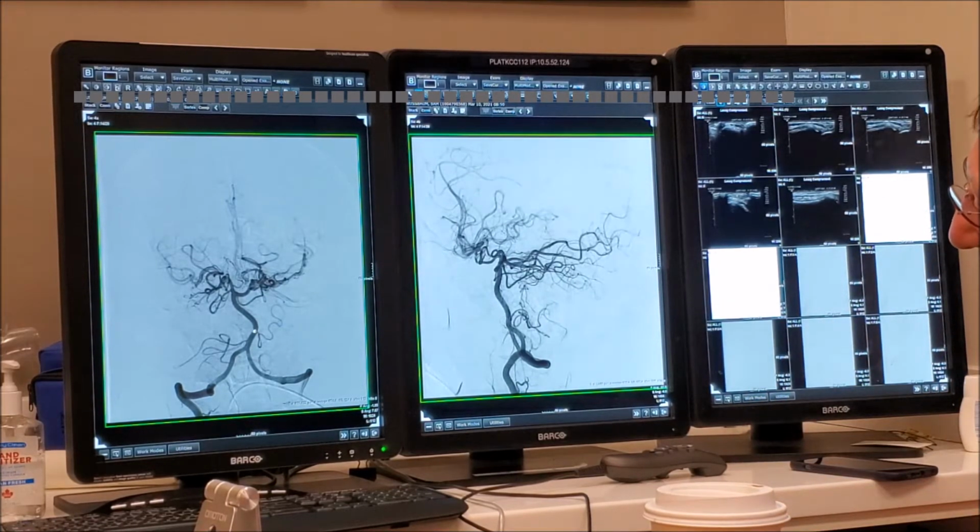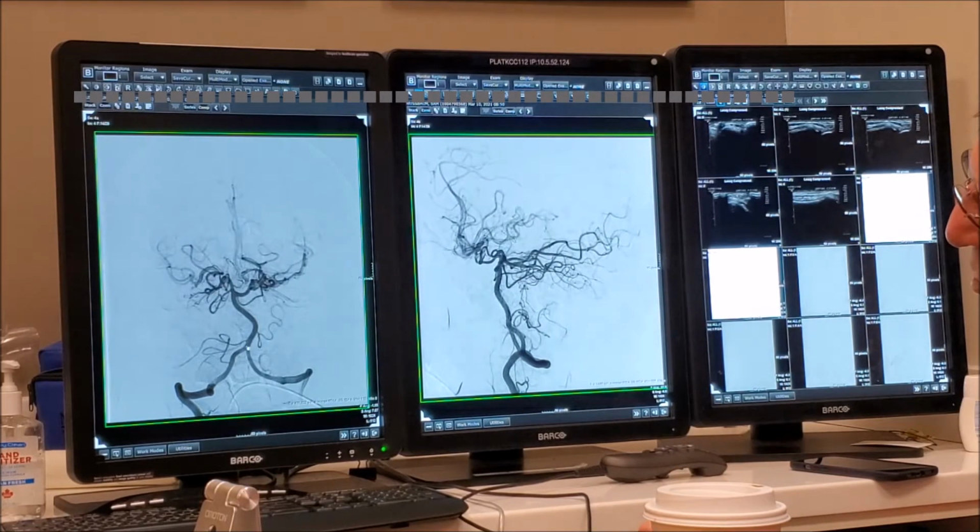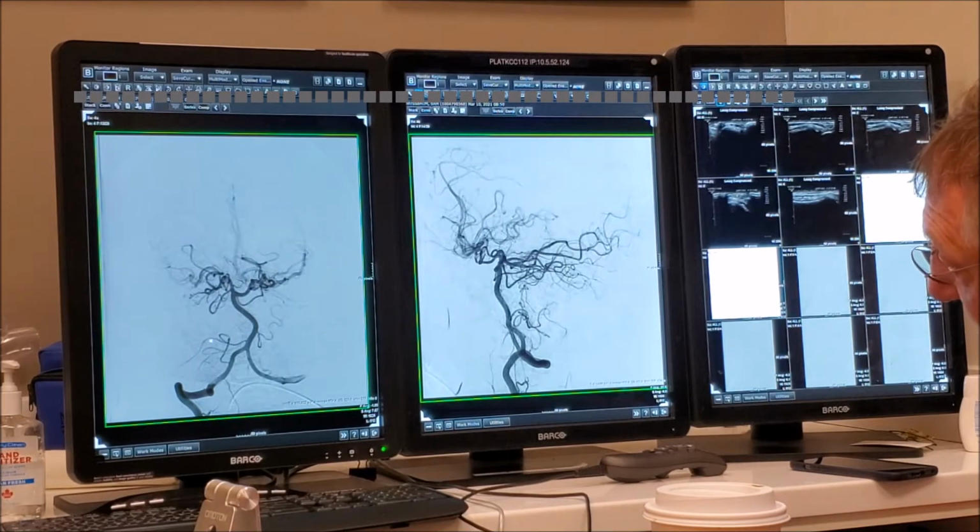There is one arrangement here, and there's a completely different arrangement here. Could you tell me the difference? Or what do you think this one is? Can we go before? I just want to see if I see anything off of lateral vert. When you see a vessel like this, you have two ways to go. You see from the origin and trace it back, or you go back and trace it back, right? So where is it originating from? It's distal, proximal basilar. Proximal.